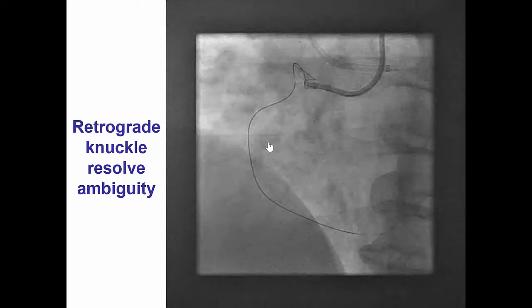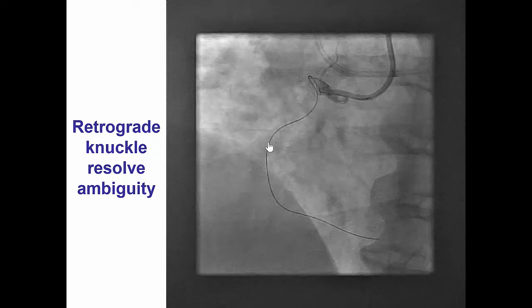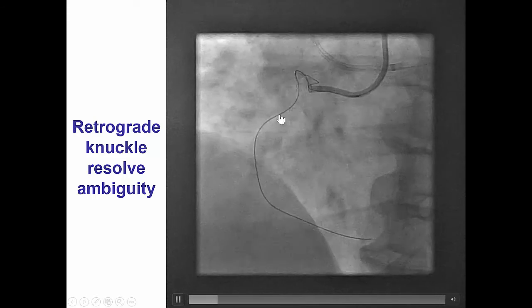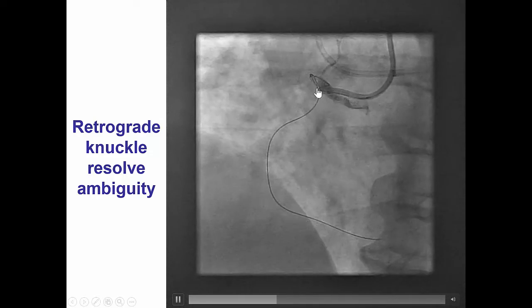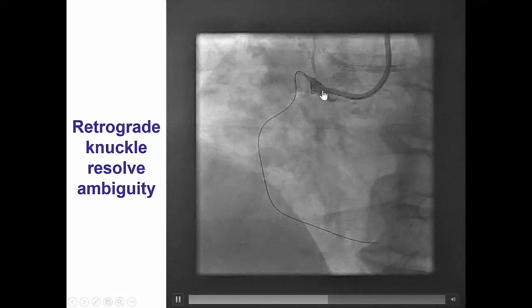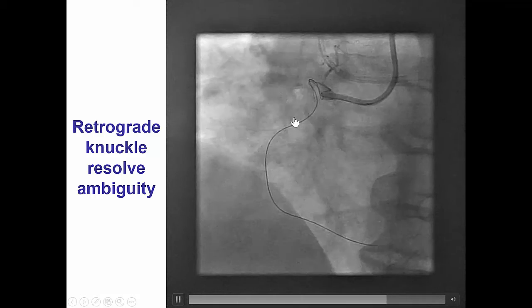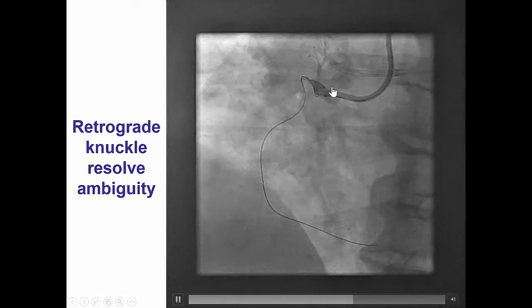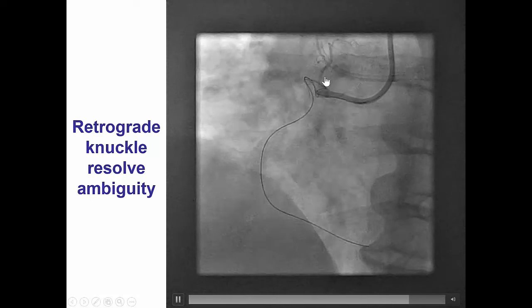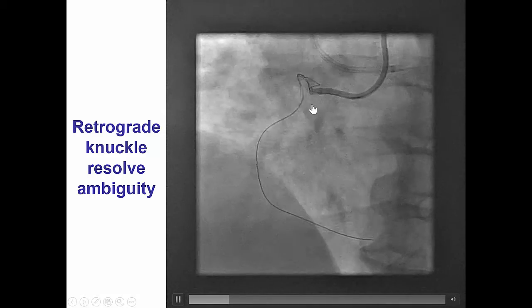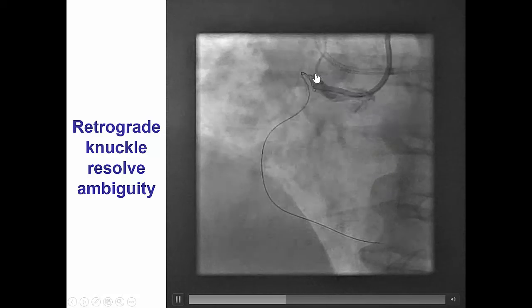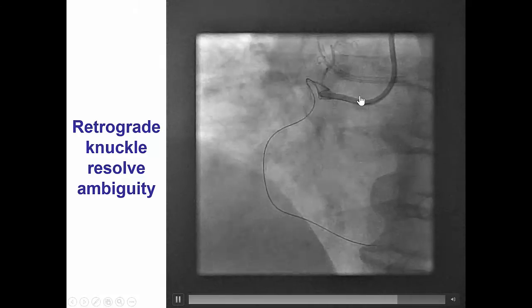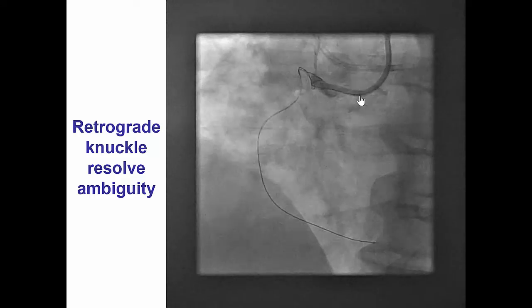To understand the vessel course, we performed retrograde crossing. We were able to go sub-intimal and advance the retrograde knuckled wire all the way to the proximal right coronary artery. This essentially explains why we were unable previously to wire in the antegrade direction — there is a tremendous amount of tortuosity and bends in the proximal right coronary artery that was very hard to understand without having this retrograde knuckled wire.